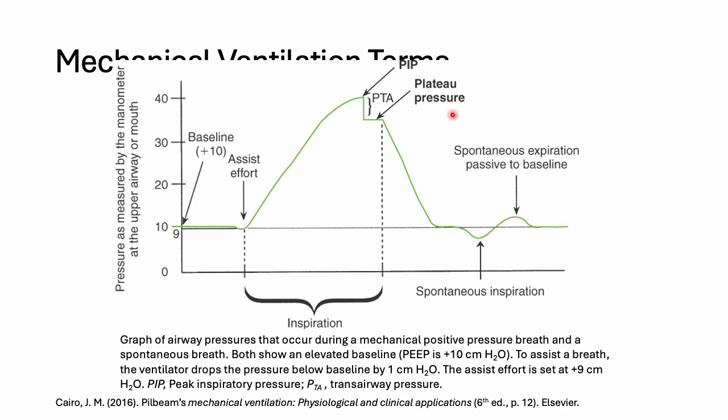Do we put in a breath hold all the time? No. Most practitioners or clinicians don't put in breath holds anymore. In the past, some people put in breath holds because there was a belief that holding the breath may help with lung recruitment and may help with optimizing oxygenation. But that's been proven to be not as effective. So you probably won't see this kind of graph on mechanical ventilators anymore. Just be mindful that this is purely for understanding the concepts of mechanical ventilation.